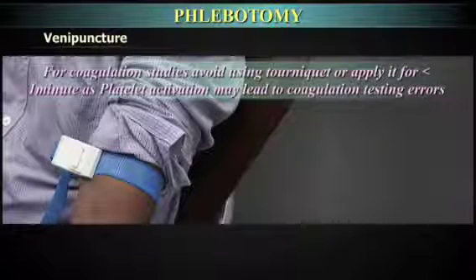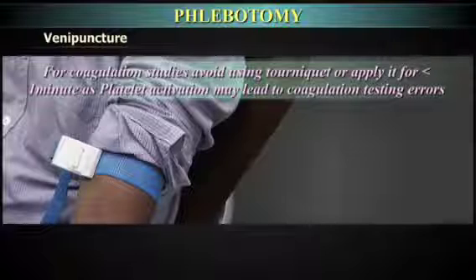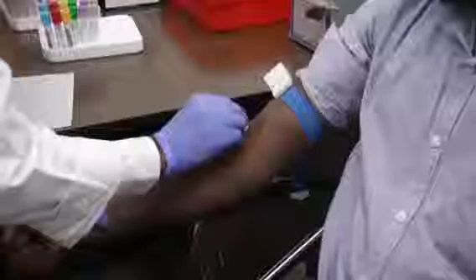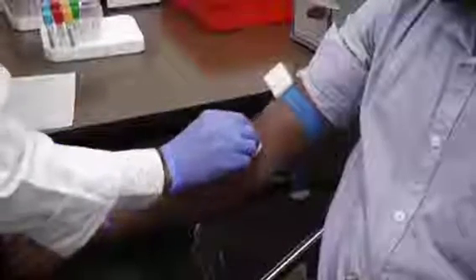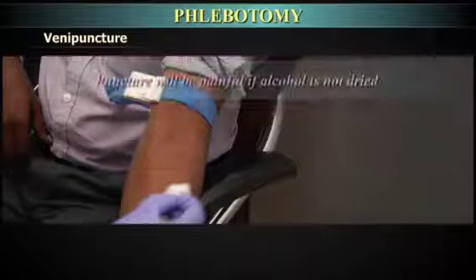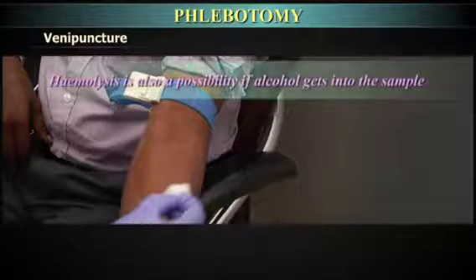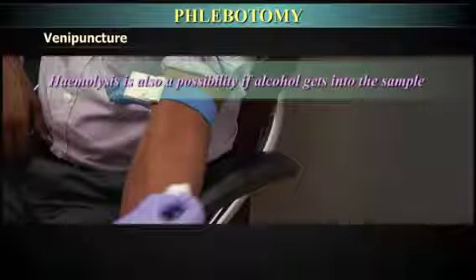For coagulation studies, avoid using tourniquet or apply it for less than 1 minute, as platelet activation may lead to coagulation testing errors. Clean the venipuncture site with 70% isopropyl alcohol swabs or sterile swab using a circular motion from the center to the periphery. Never do the reverse. Allow the area to dry before venipuncture. The puncture will be painful if alcohol has not dried. Hemolysis is also a possibility if alcohol gets into the sample.